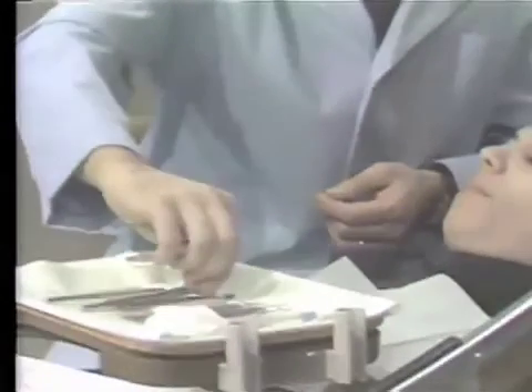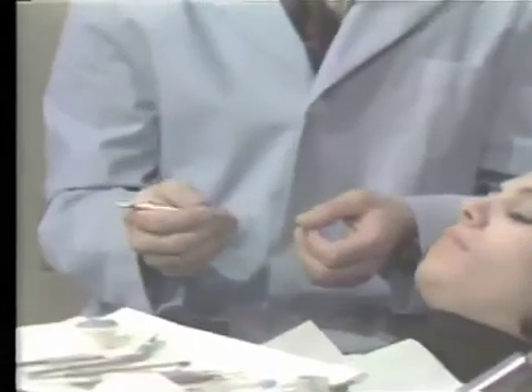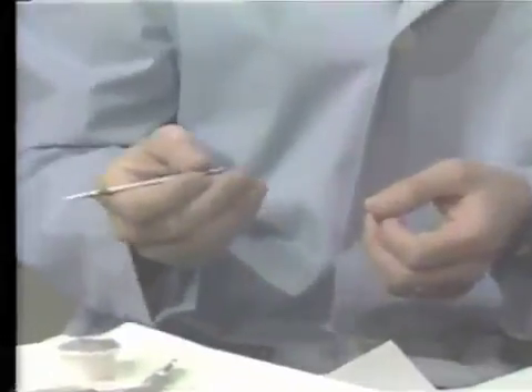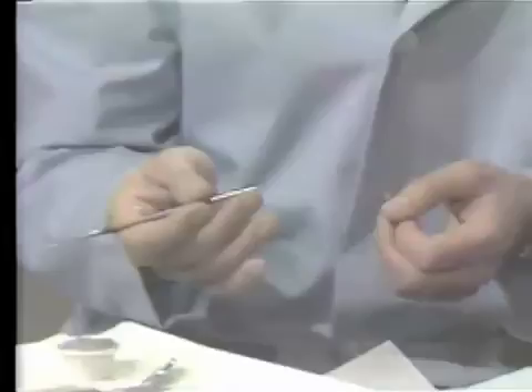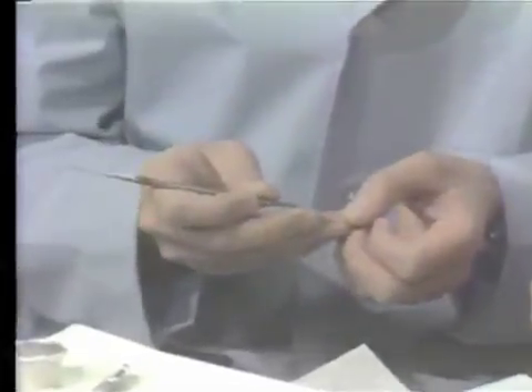Now let me demonstrate the use of the exploring stroke. The exploring stroke is used with both explorers and scalers. The most sensitive way to explore a tooth is with the finest tipped instrument. Let me demonstrate the exploring stroke on my thumb — it's a gentle but firm grasp on the explorer, moving the explorer back and forth. You want to keep the tip end of the scaler or explorer next to the surface of the tooth.